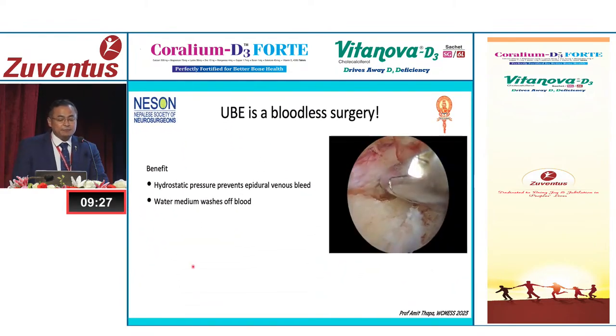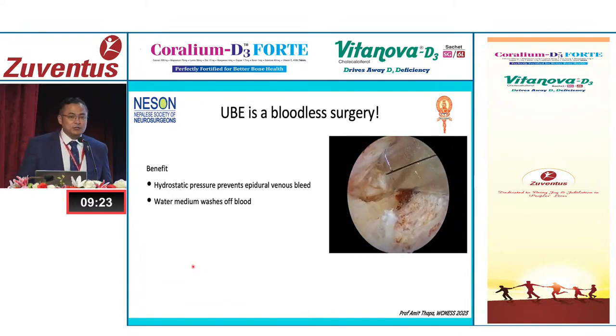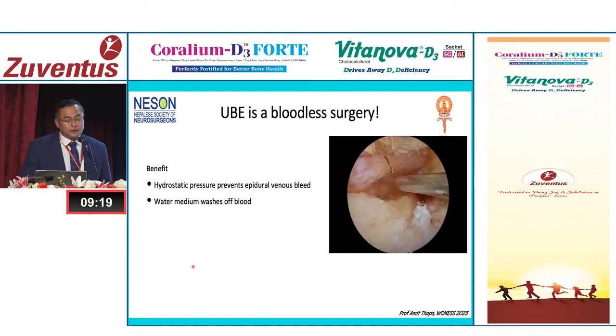So UBE is a bloodless surgery, and that's the reason I took up this surgery over the tubular surgeries, which I have been doing for the last 2 decades. The benefit is definitely the hydrostatic pressure, which prevents the epidural venous bleed. The water as a medium washes off the blood, and that's why it provides a clean feel.